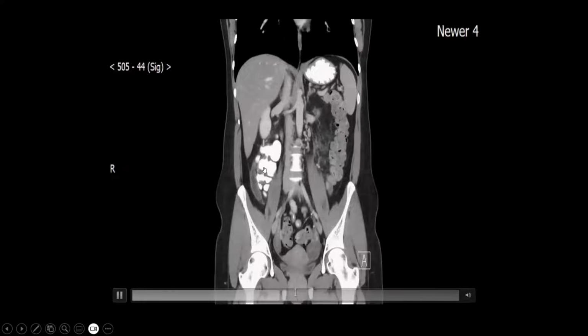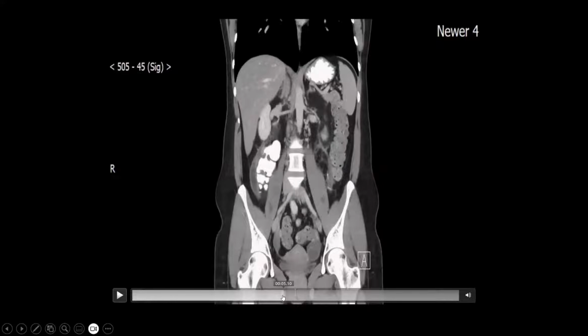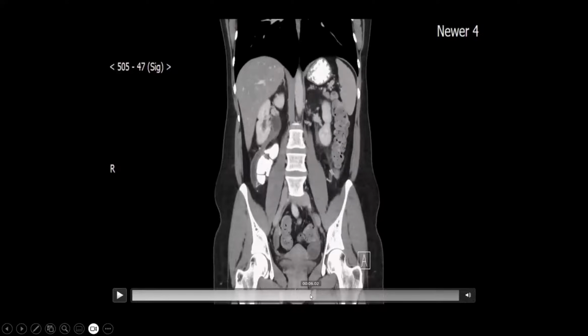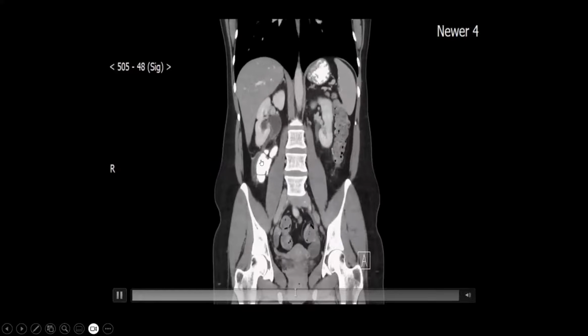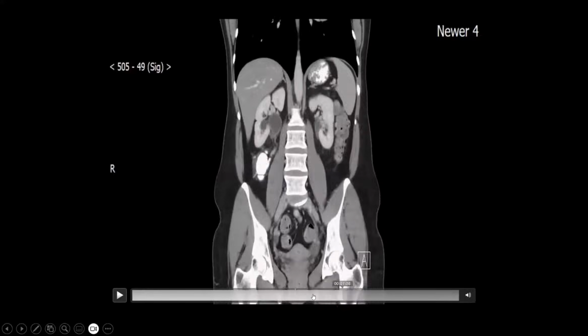Yeah, they are. Oh yeah, and there's surgical resection. Was there like a liposarcoma or some kind of retroperitoneal mass? There was retroperitoneal fibrosis because of IgG4. So the ureters were intraperitonealized. So this is paracolic gutter on each side where the ureters are placed.